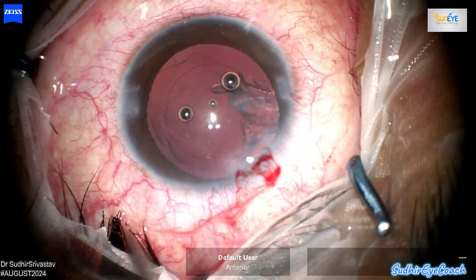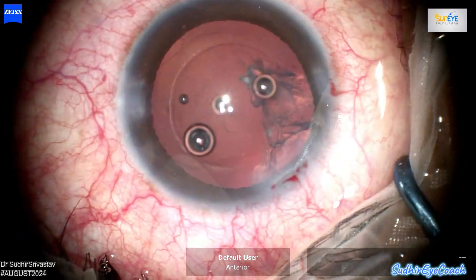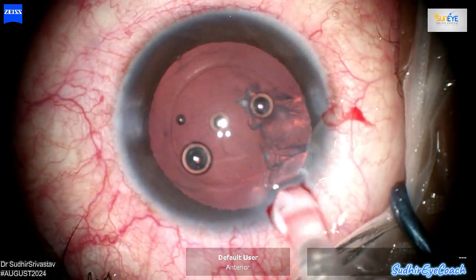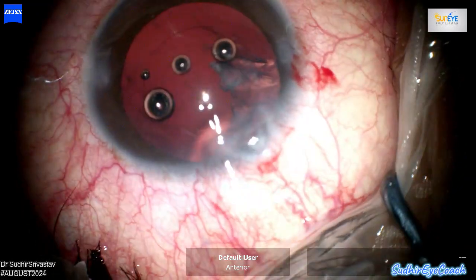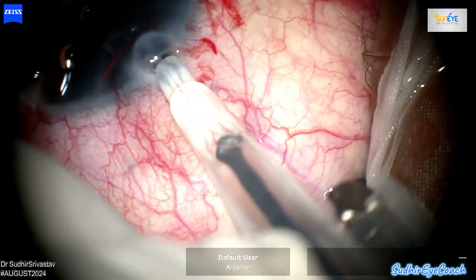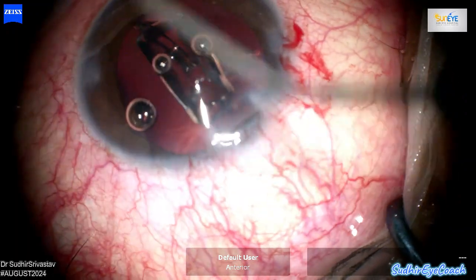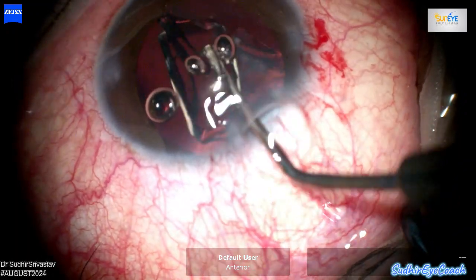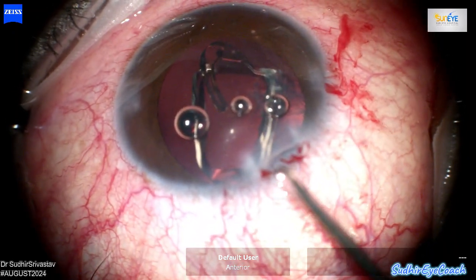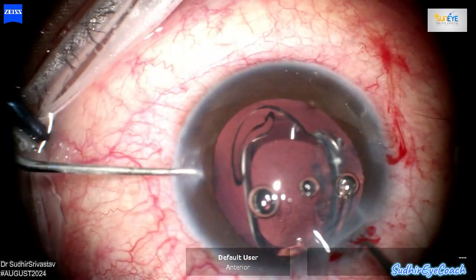So I decided to forgo further cortical matter removal and proceed with intraocular lens implantation. I filled the chamber again with viscoelastics and the eye is ready for implantation. I started implanting a single-piece hydrophobic lens, with the idea to insert it and keep the lens over the anterior capsule. Since the hydrophobic lens opens gradually, it provides ample time for proper lens repositioning and placement. I waited for the lens to gradually open in the anterior chamber.